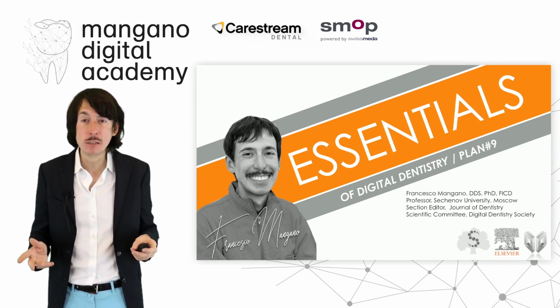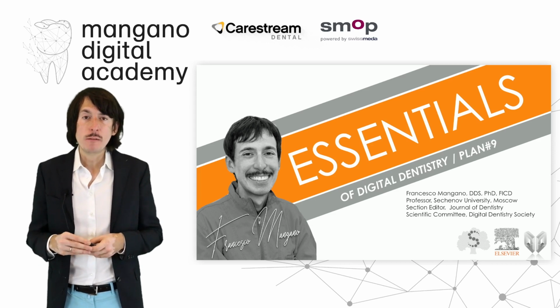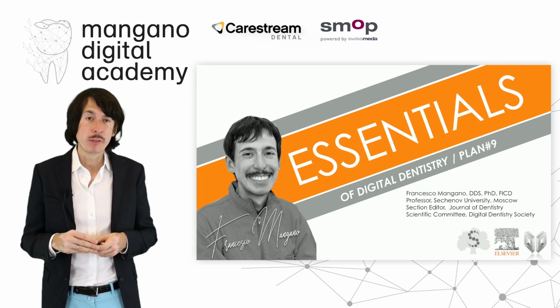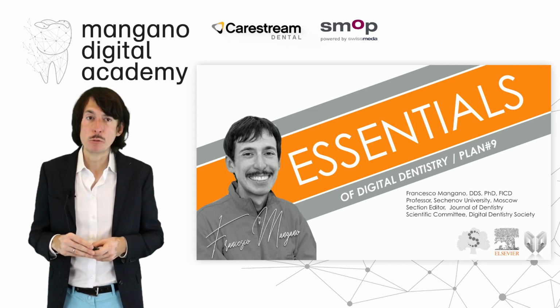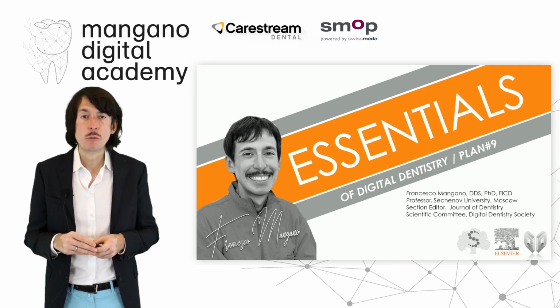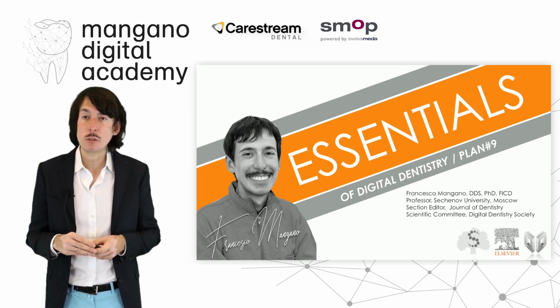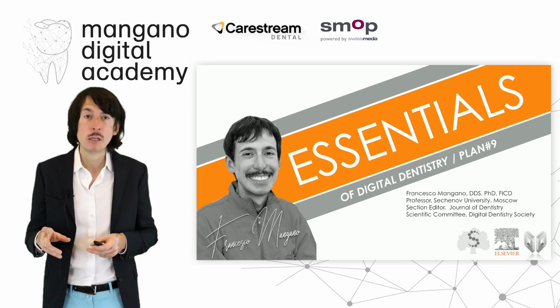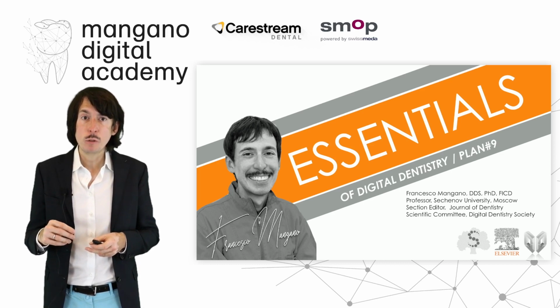In this series of videos and lectures, we have talked about different aspects of planning with digital dentistry, particularly in implant prosthodontics, but also in prosthodontics in general. And in this lecture, I will talk about an interesting opportunity that we have now for prosthodontics, also for gnathology, and potentially also for orthodontics. We will talk about the digital bite splint.